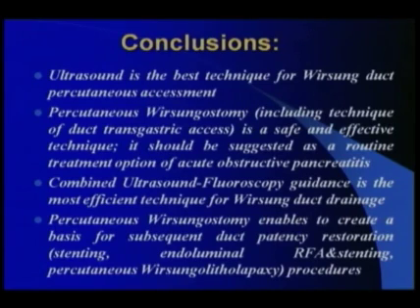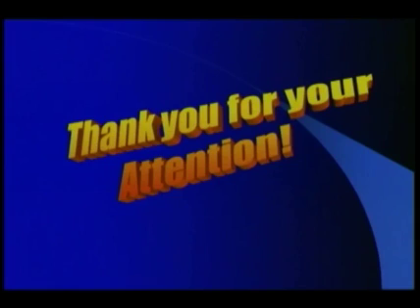Percutaneous wirsungostomy enables us to create a basis for subsequent duct patency restoration procedures, such as stenting or endoluminal RFA and stenting, or even percutaneous wirsungolitholapaxy. Thank you for your attention.